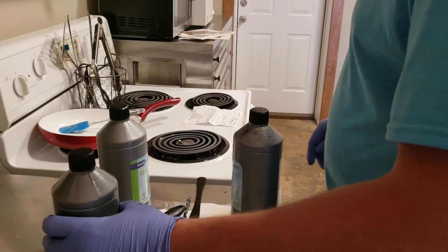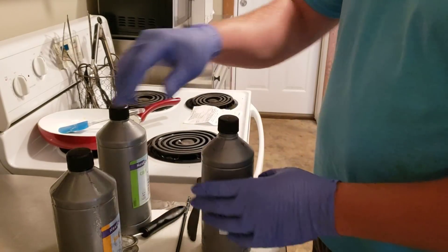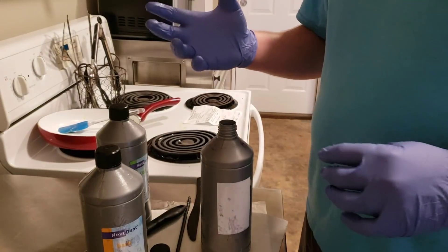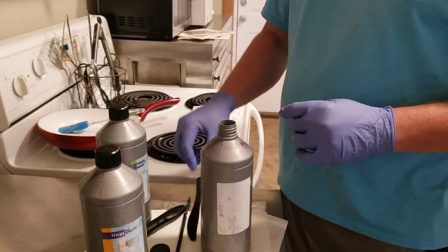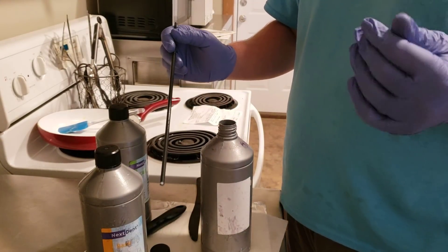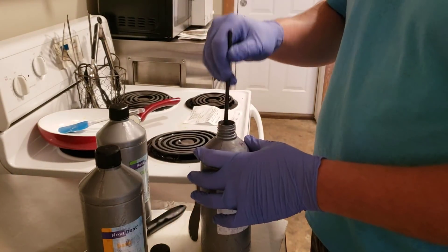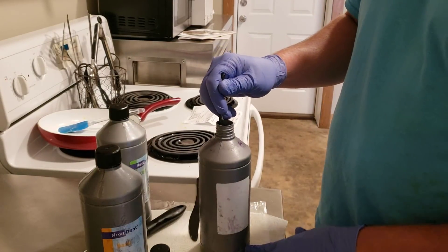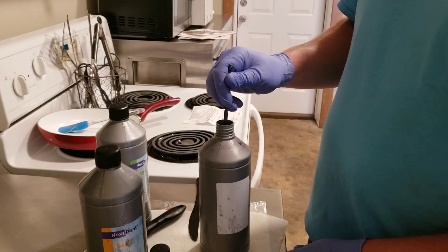A couple quick tips for things I've found useful when printing. When using the Nexdent base, the Nexdent crown and bridge materials, the MFH, I find it really common that when I shake it — sometimes 5-10 minutes — and then pour it in, it still looks like it's not the right color and consistency. That's because these materials have so much filler particle in them, and that filler particle is really prone to settling down at the bottom and is very resistant to coming off, even with vigorous shaking.